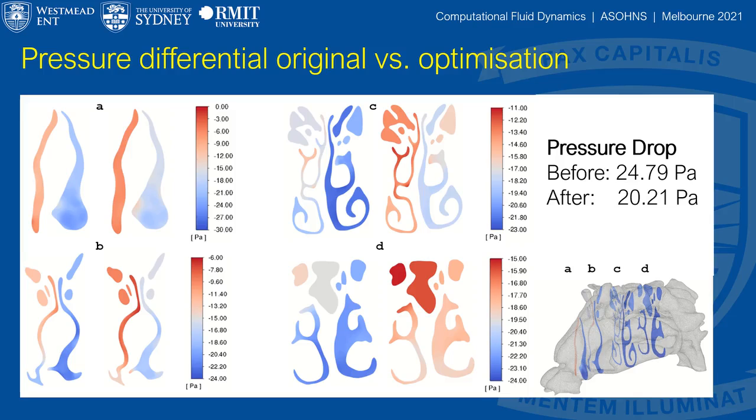However, minimal geometry reduction was required to achieve this, highlighting that pressure drop may not be a suitable observable for optimization. Slight modification of the left-hand side geometry was also observed, indicating the tool is not completely adhering to the design limitations. To address these issues, multiple observables will be employed at localized regions along the right septal regions, and the optimization will be reiterated.